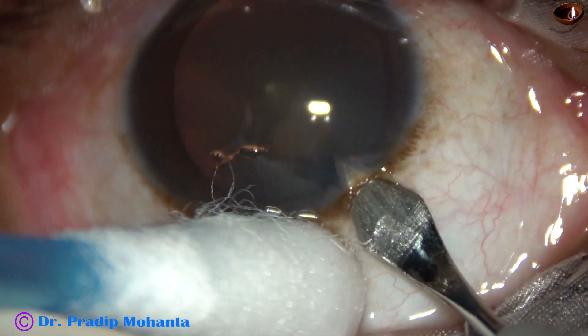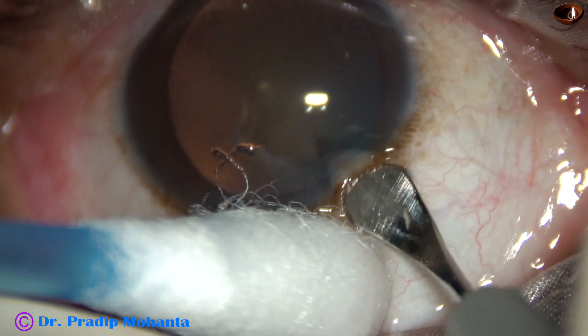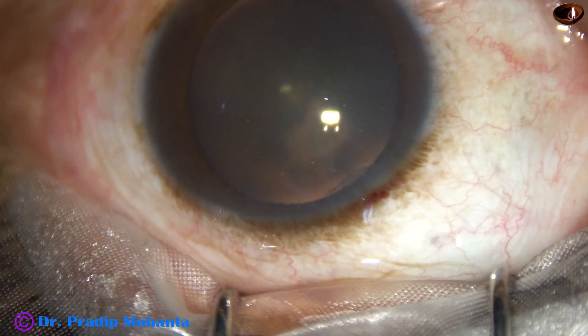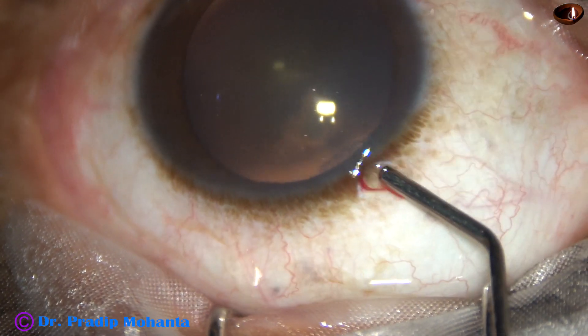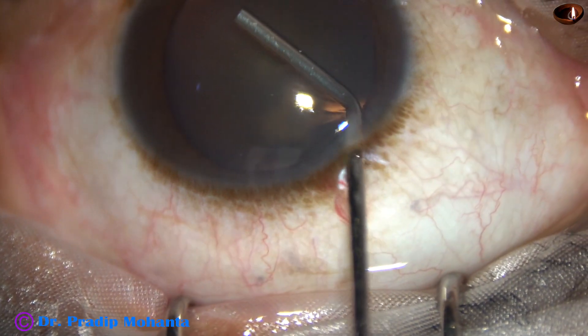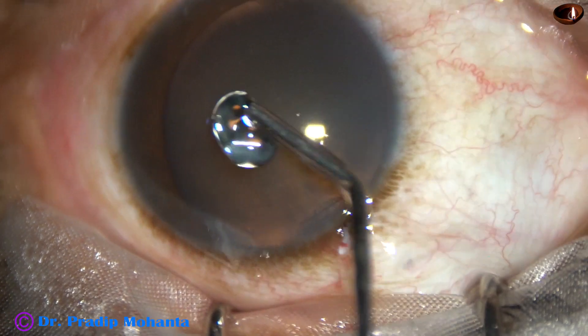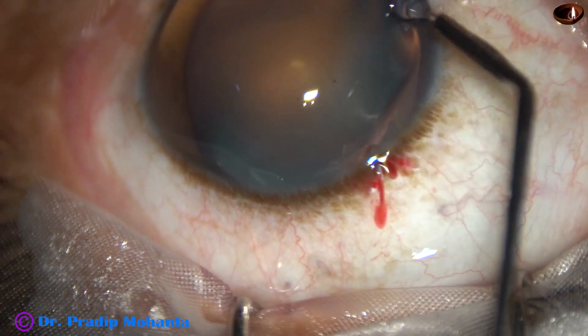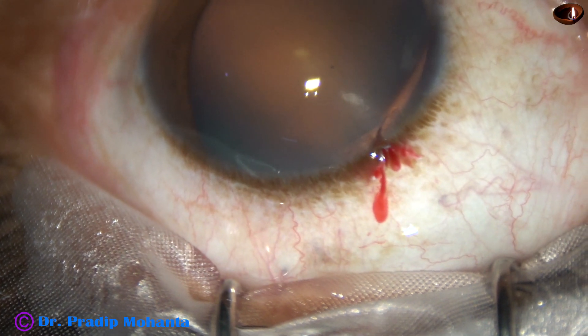This is the main incision at the posterior aspect of the limbus. Now 2% HPMC is injected into the anterior chamber and applied over the cornea. It improves visibility.